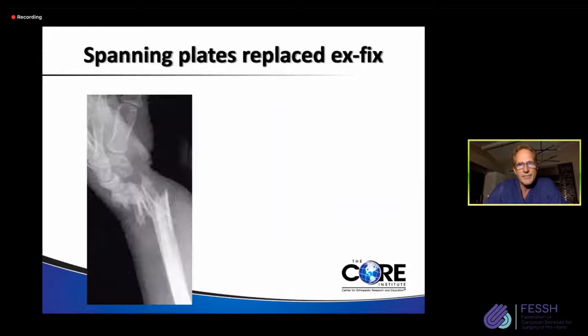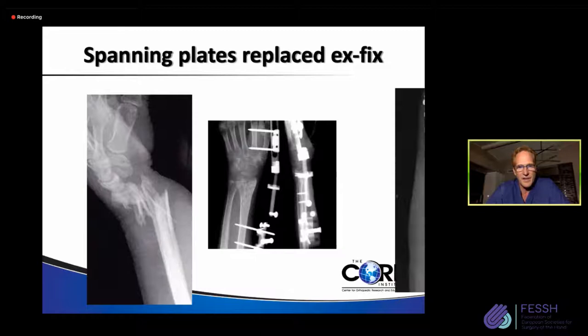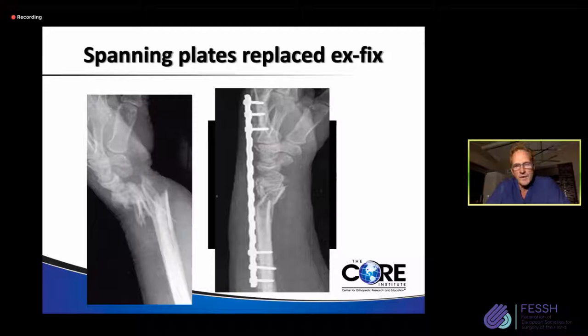So basically, X-fix has developed a very bad name in the United States. And so we are constantly looking for something to replace it and something perhaps better. And so that's the advent of replacing the X-fix with a spanning plate, which essentially did the same thing and hopefully avoided many of these complications.